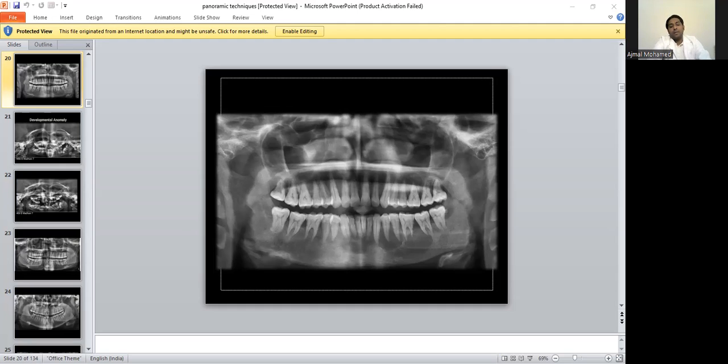So when you prescribe an investigative modality like OPG to a patient, always keep in mind that OPG is not good to identify a lesion in a single tooth. Always prefer to send the patient for investigation of multiple teeth. And in case of a periapical or bitewing, a film is actually preferred in dental cases, if you want to check periodontal involvement for one or two teeth, or in case of early periapical pathology.